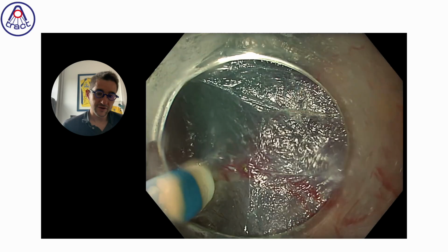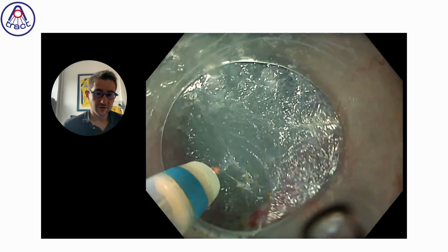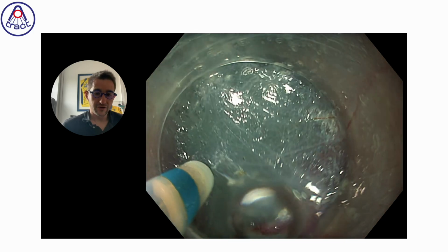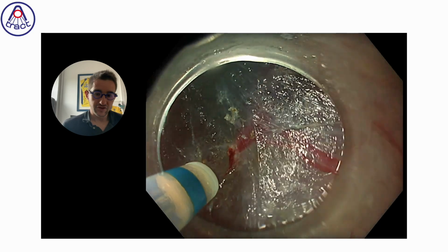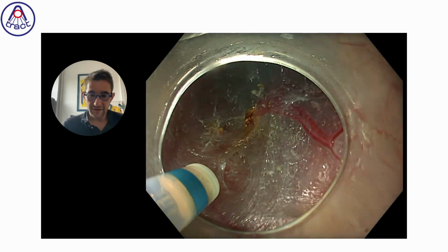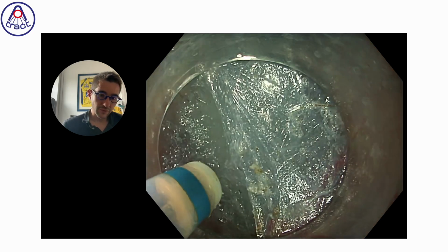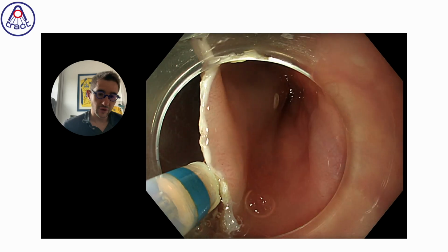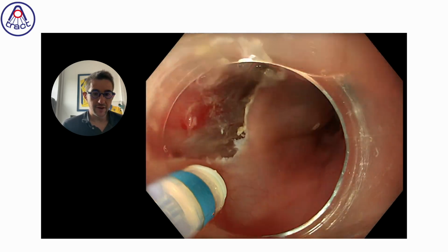So here there is a vessel, we coagulate it, prepare it, and therefore follow our dissection. Sometimes there is still a small bleeding, which is easy to control if you have left enough space around the vessel, and then we go straight, trying to stay close to the muscle, controlling the direction here.